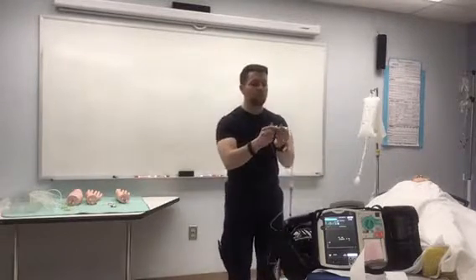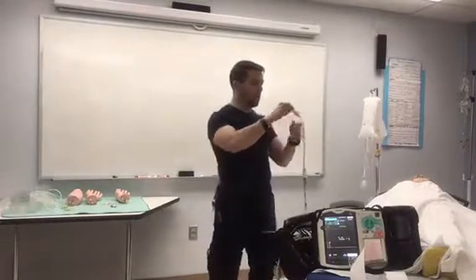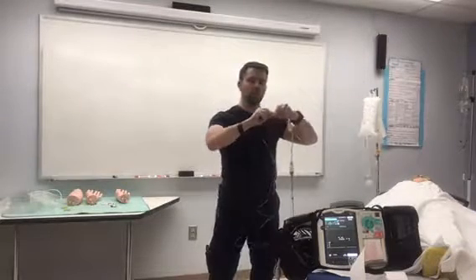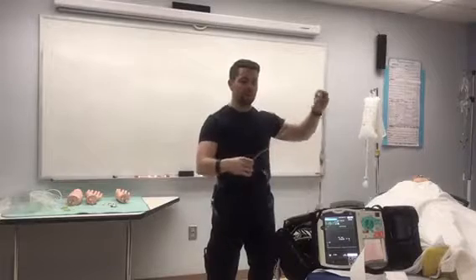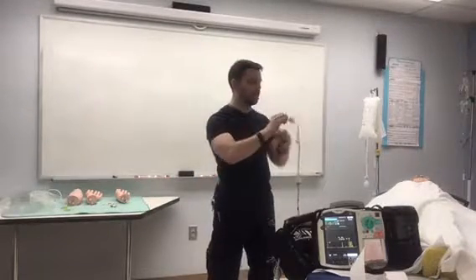The other thing that can cause too much dampening is if all of our multiple connections, our screw-on multiple connections for the actual line, have become loose and they're leaking a little bit. Okay, so our connection here, our connection here. If they're loose, that can also create too much dampening.